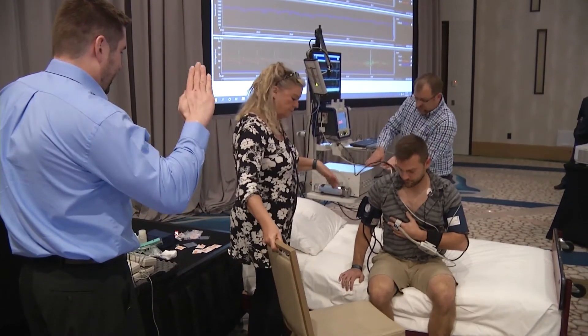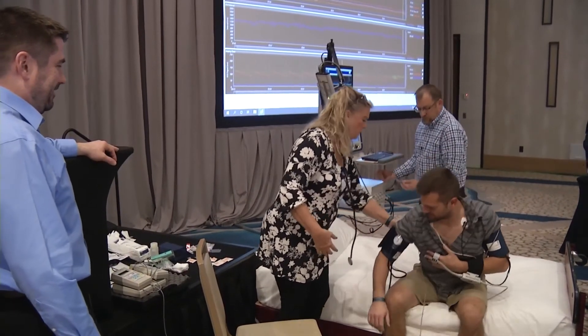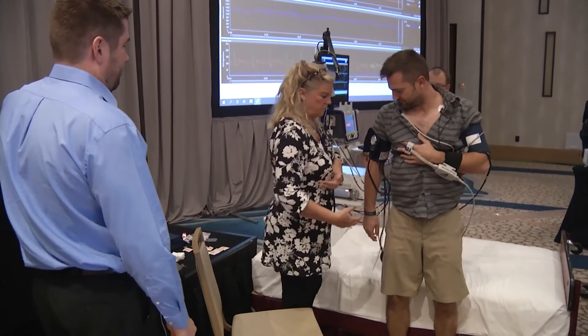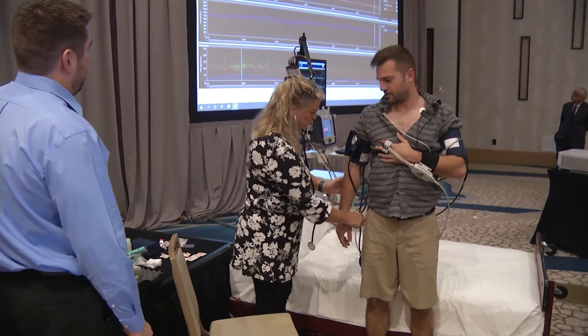Just imagine the tilt table going up now with an arm out — but if they have a problem you can always support it here. You okay, Jade?